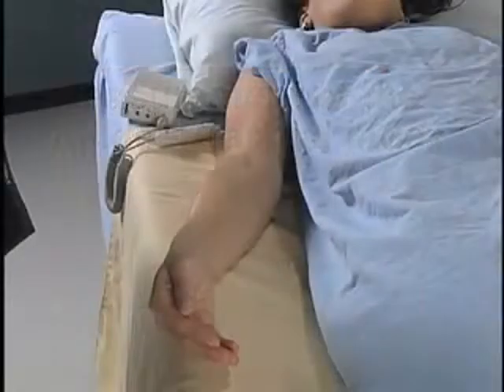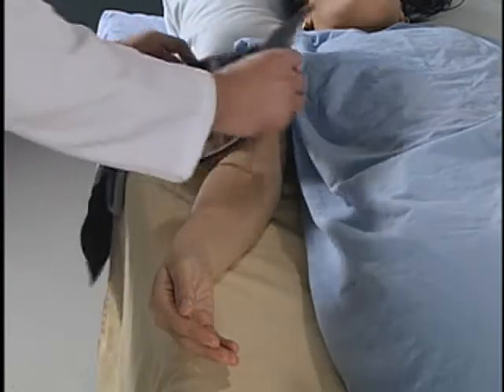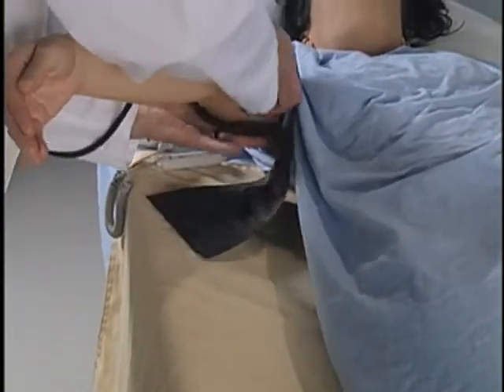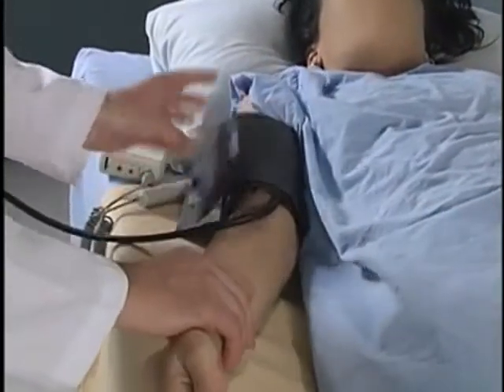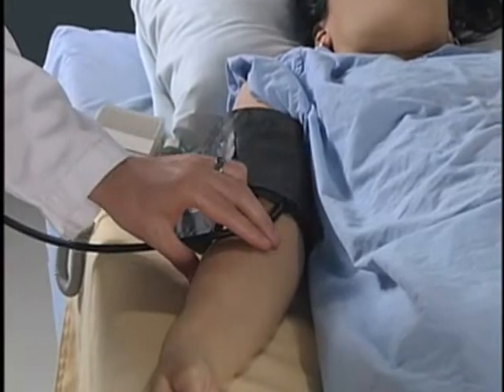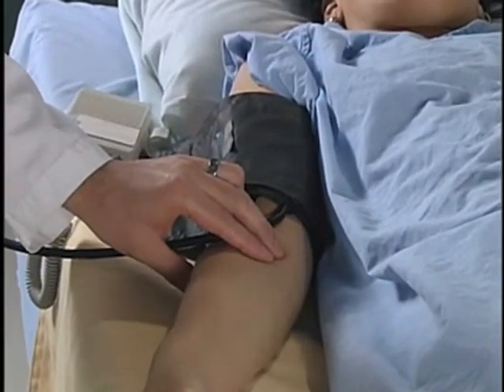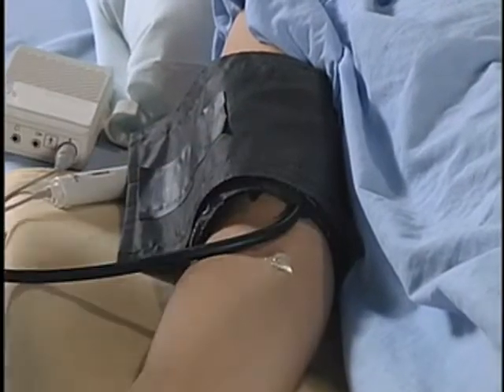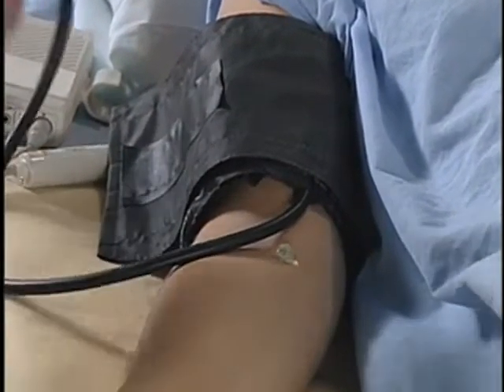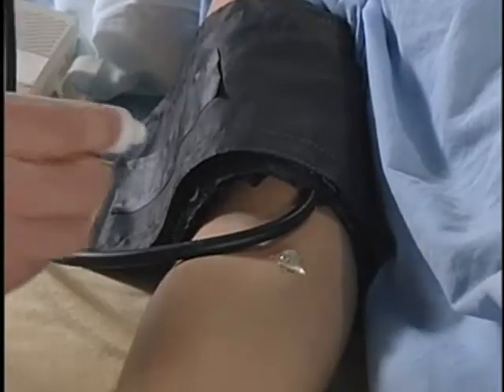To measure the ankle brachial index, you will first need to measure the arm blood pressure with the Doppler probe. It is important to choose a sphygmomanometer cuff of the appropriate size. This is placed over the upper arm. Palpate the brachial pulse and apply gel with the probe at the site where the pulse is felt. Place the Doppler probe lightly on the gel at a 60-degree angle towards the patient's head.